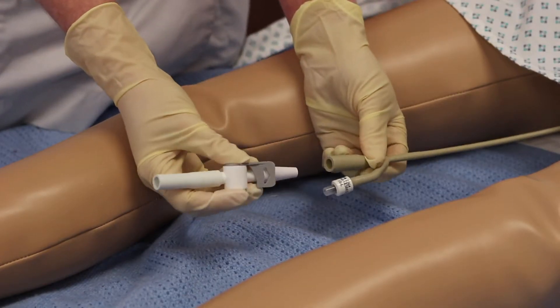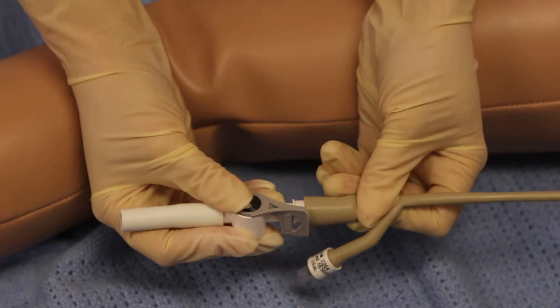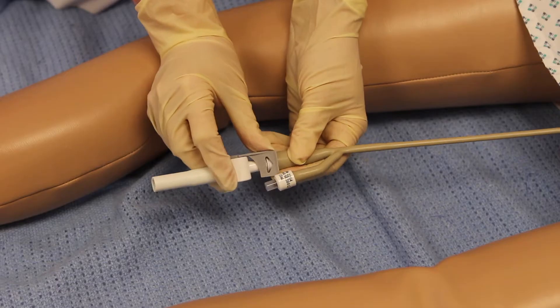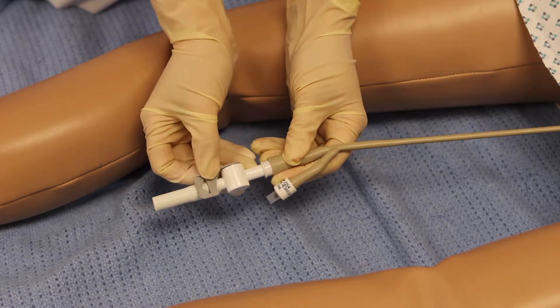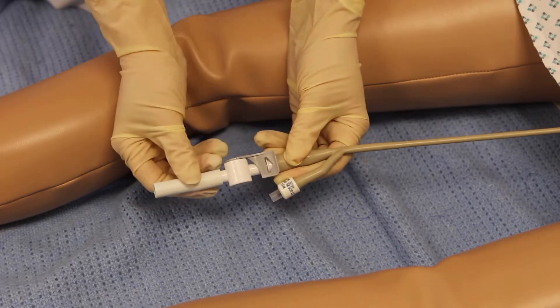Alternatively, you will be given a drainage valve or flip flow to connect to your urinary catheter. To attach the flip flow, push the rigid end into the urinary catheter. To drain the flip flow, position the tap to a downward position. When emptied, reposition the tap to the upward position.